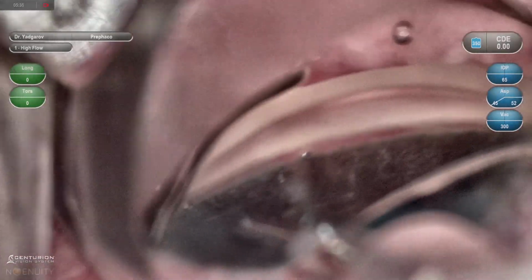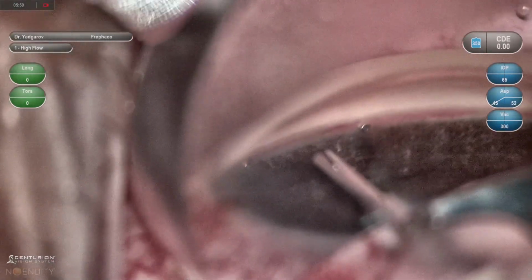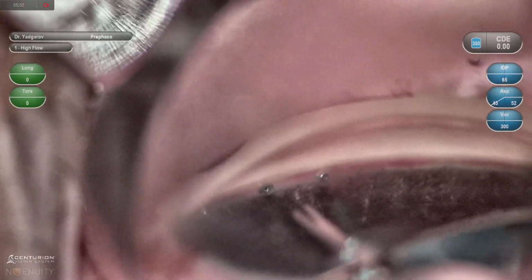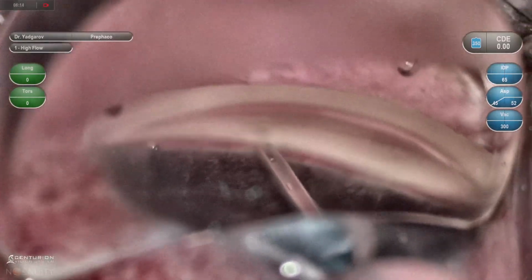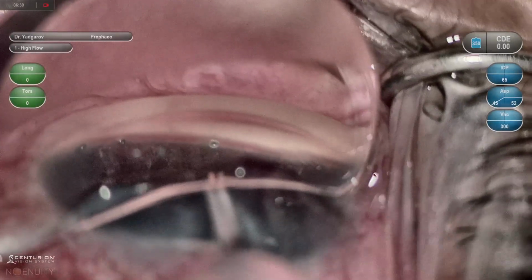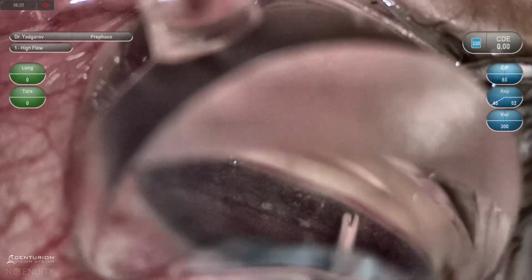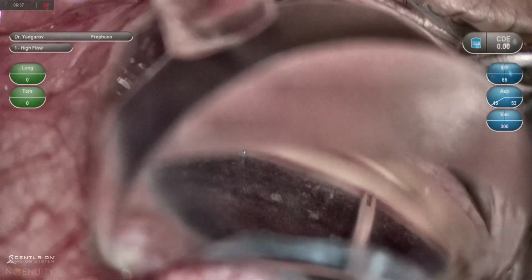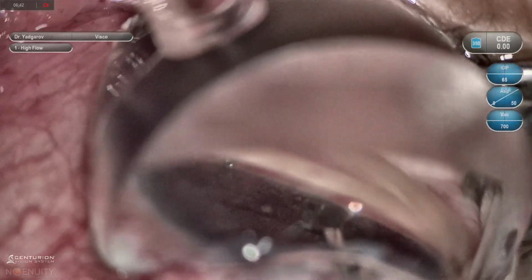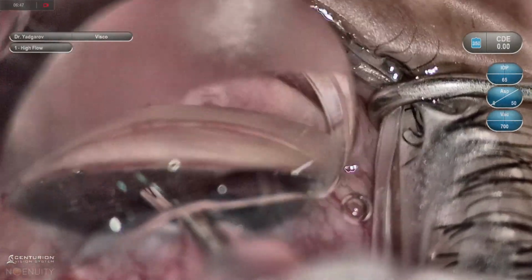This next case is different in the fact that this is an eye that's had a previous I-stent inject, and this generation was prior to the I-stent inject W, so you can see that the flanges are a lot smaller, especially in comparison there with the larger flange of the I-stent Infinite. Since these I-stent injects are a lot smaller, they take up less real estate, so it is easier to space out the I-stents, and there's just more trabecular meshwork to work with. And so this eye has 5 trabecular stents, 3 that are fresh and new, and 2 that previously failed.